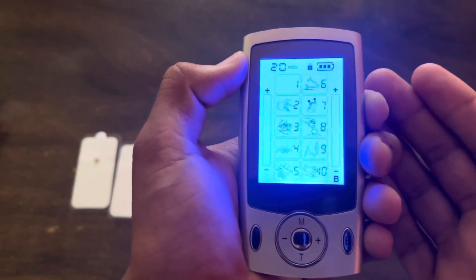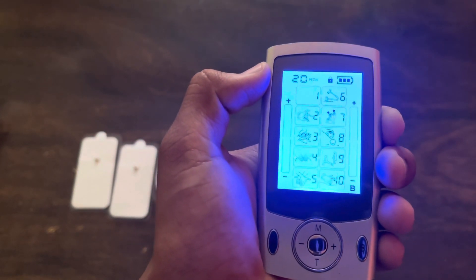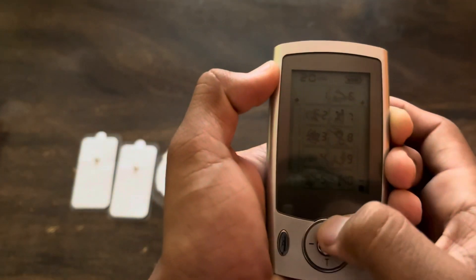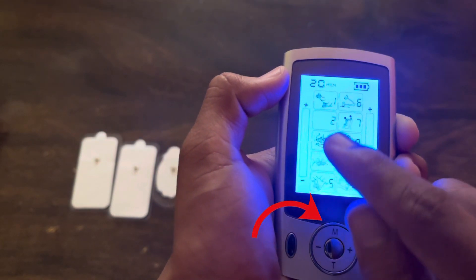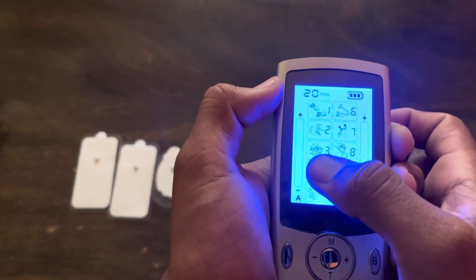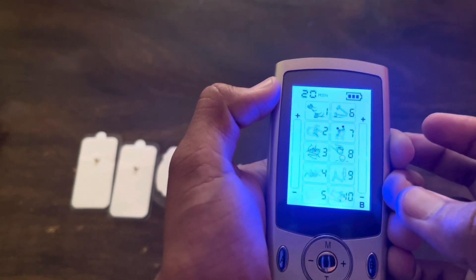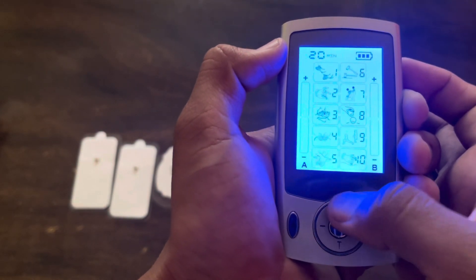This unit offers a pretty decent display with different modes. In total there are 10 modes which are given in this unit. In order to select different modes, you have to press the M button which is given in the topmost portion. By pressing this M button, we can select different modes — second mode, third mode, fourth mode, fifth mode — depending on your choice.